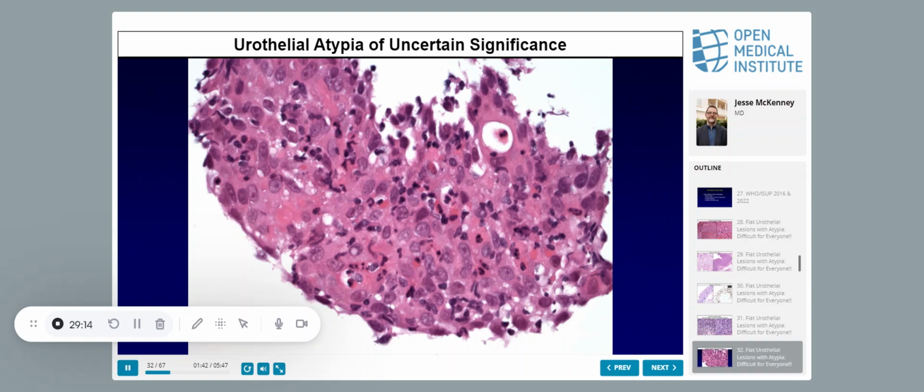One of them is if there's a threshold for the number of atypical cells. So if the nuclei are big and very atypical, but it's only one or two of them. So the question is, how many cells do you have to have to call carcinoma in situ?